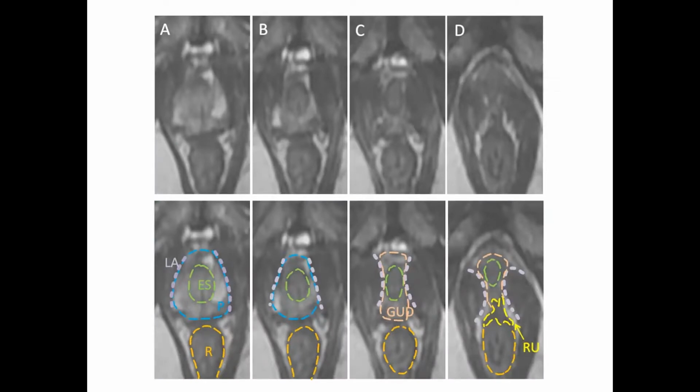So now if we look at the MRI, I always say this muscle has been hiding in plain sight. So it's a thickened area in the rectal wall. It looks like a bad wig. And then the muscle extends up right into the GU diaphragm here. So you've got the GU diaphragm levels clearly. Here's the levator inbowing, starting to inbow here. It's concave, starting to be convex. Here it's convex, very clean. You're in the GU diaphragm here.